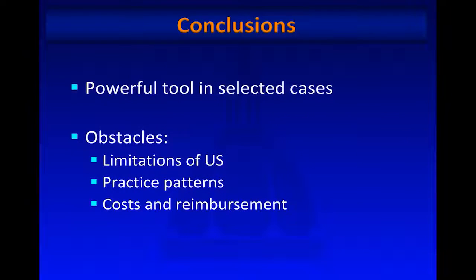So in conclusion, then, contrast ultrasound is a powerful tool in selected cases, and I hope I've shown you some applications where you can use it. There are some obstacles that we still need to overcome. There are limitations inherent to ultrasound. Practice patterns, especially in the United States, where CT and MR are much more widespread. Issues of logistics, how you are going to schedule the patient, and issues of cost and reimbursement, which is now finally being addressed.